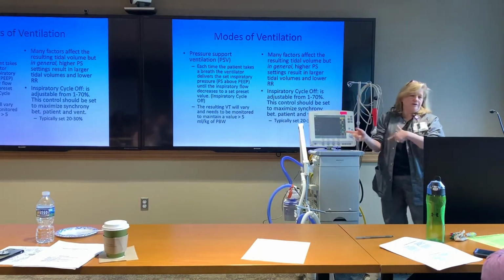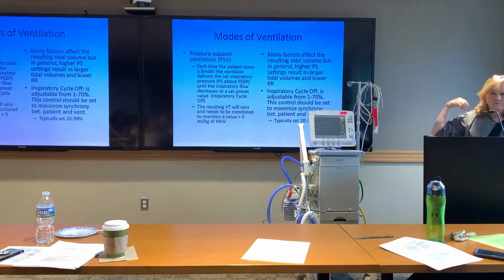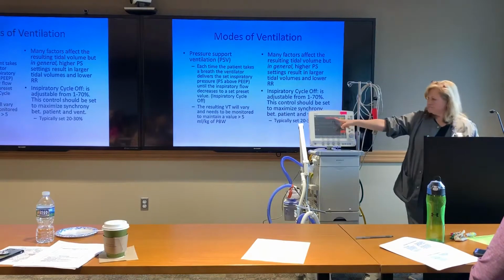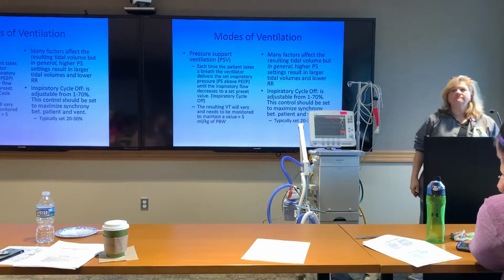If the patient stops breathing in pressure support CPAP mode, the ventilator will kick in and start ventilating him at a set rate. Now, if I'm doing a spontaneous breathing trial and my backup rate is set at 15, it will kick in any minute now. It just seems like the longest time. There we go. So it'll tell you right here, no patient effort, right? No patient effort. So I can come in and silence it.